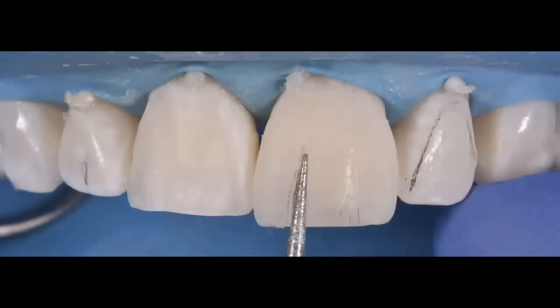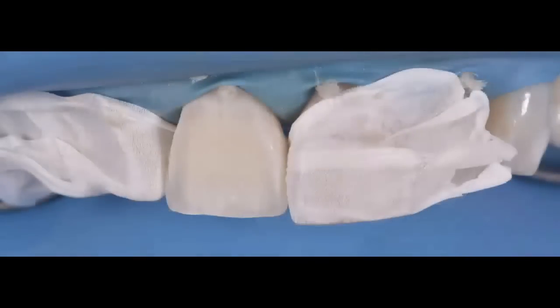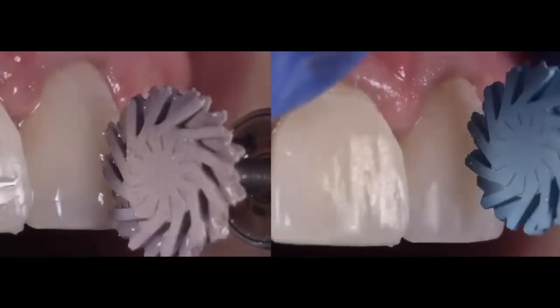I'm going to add a little bit of tertiary anatomy there, and there I go. I protect the neighboring teeth, and I go about restoring tooth number 8. Acid etch, prime and bond, lengthen the incisal edge, add the white opaque, add the very thin dentin layer, mesial Mylar pull, distal Mylar pull, and final facial increment. Exactly the same steps that we did before.